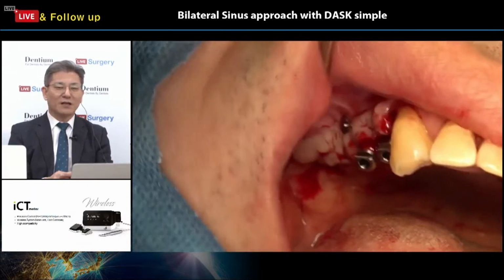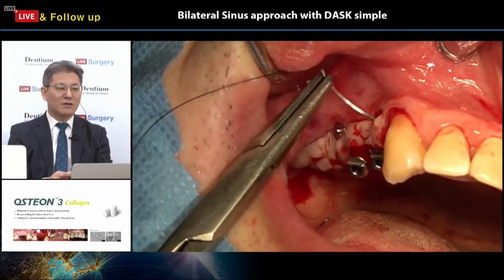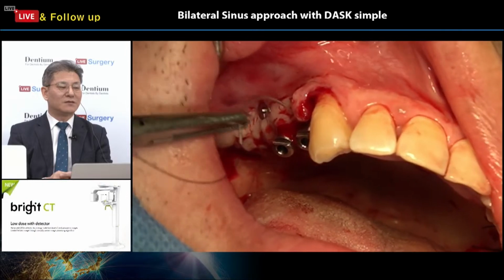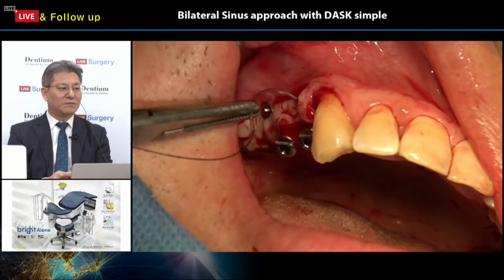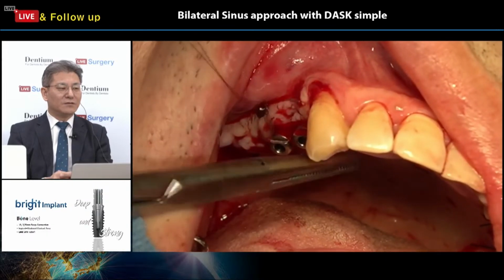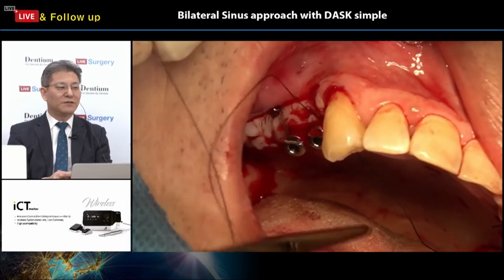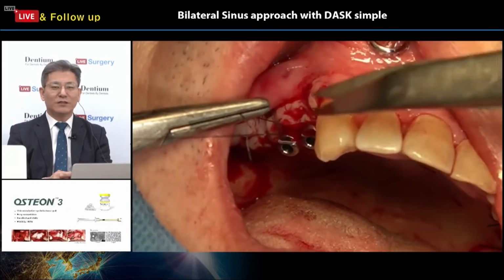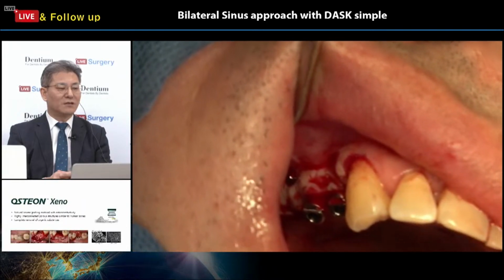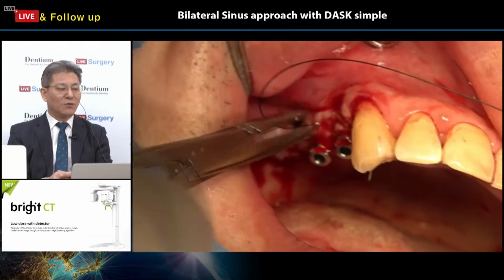Okay, sometimes this pin is time consuming. So the basic procedure is suturing. Interrupted suturing first here, and additional suture for flap closing. Additional suture is a necessary part. I think 2 or 3 more stitches are needed.